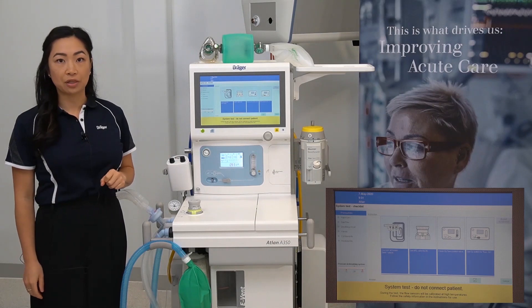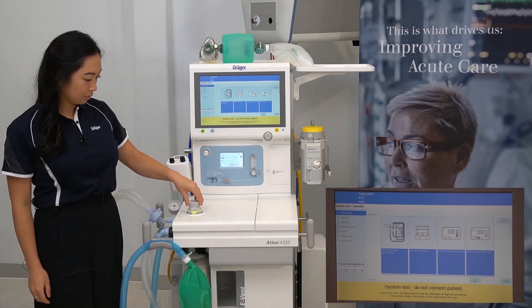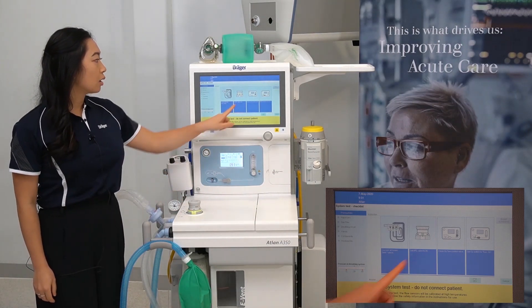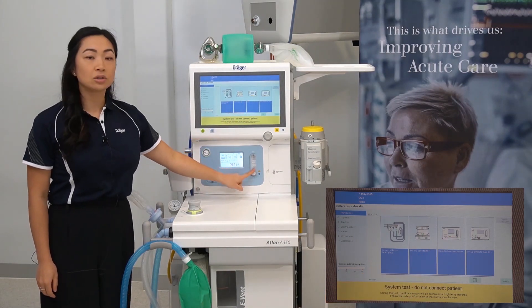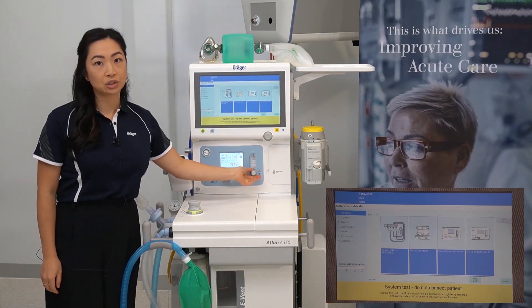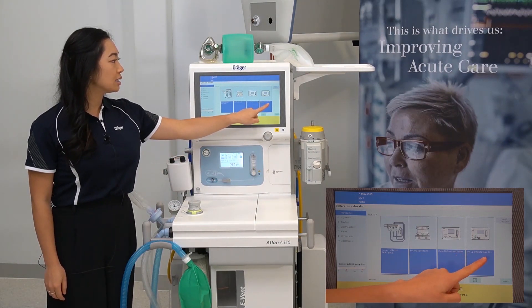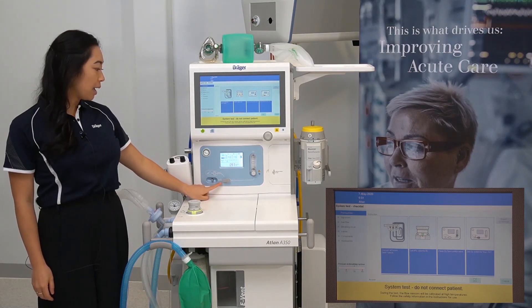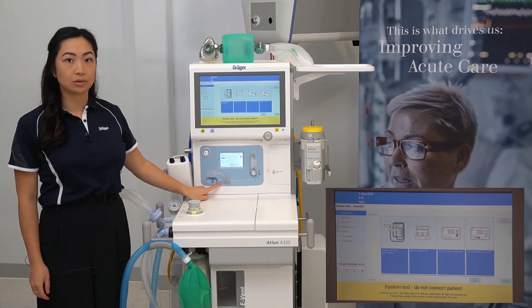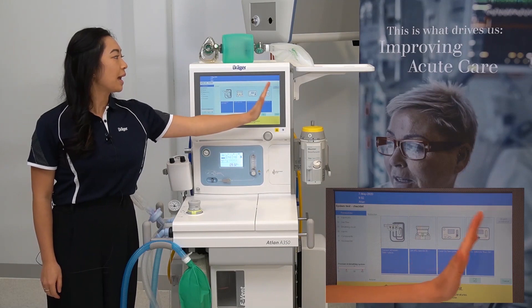Set the APL valve to 30. Close the oxygen flow control valve, making sure it is closed. Set the oxygen switch to auxiliary oxygen, making sure it's pointing to auxiliary oxygen.